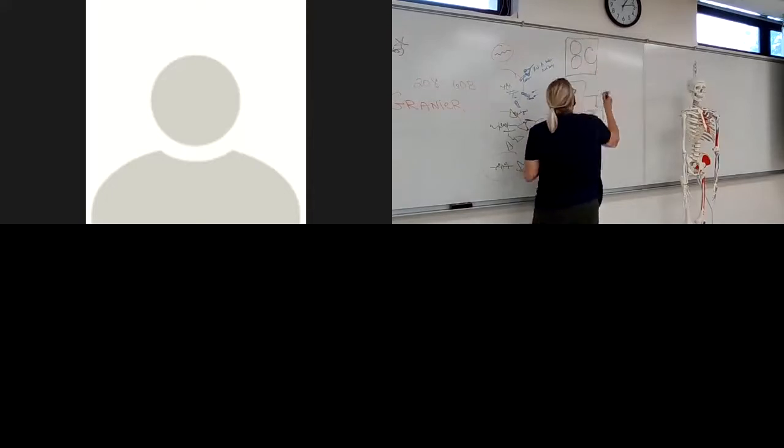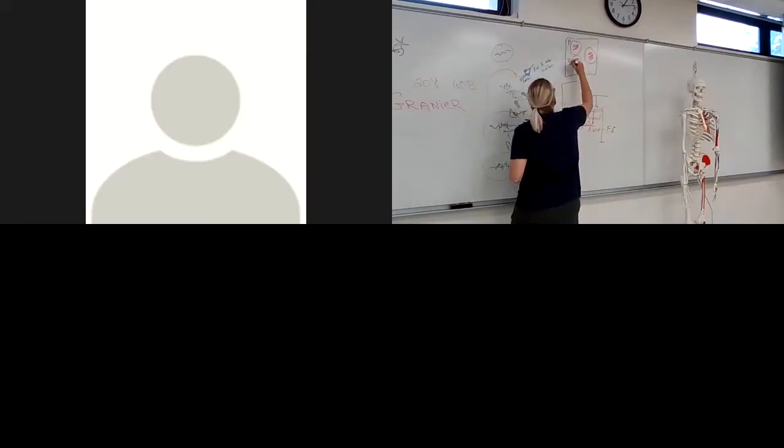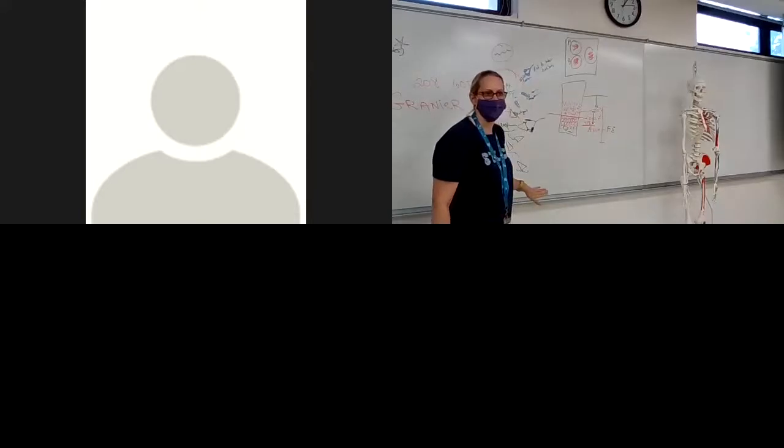Okay? And so in our little wells, all right, if I take Jen's blood and I put it in my wells, so Jen, wave your hand in the back so everybody knows who you are. All right, we're going to exclude this guy right now. On your little well, this is A and this is B. Now remember, your DNA is determining if you have these proteins on the membrane or not. And remember, I know what these proteins look like.